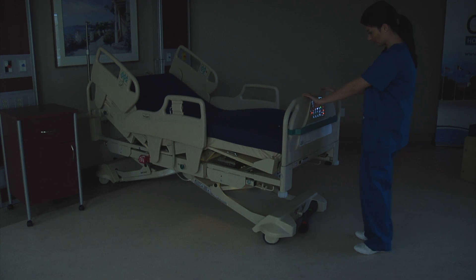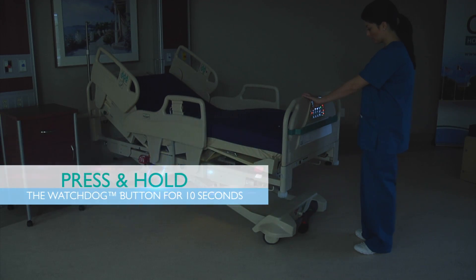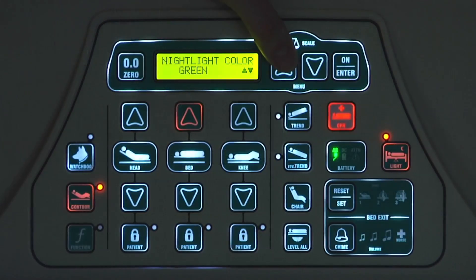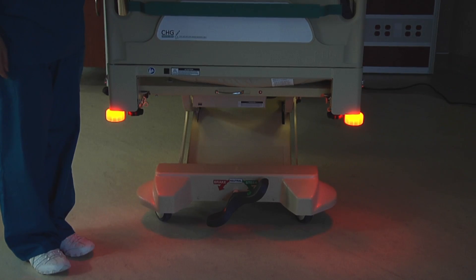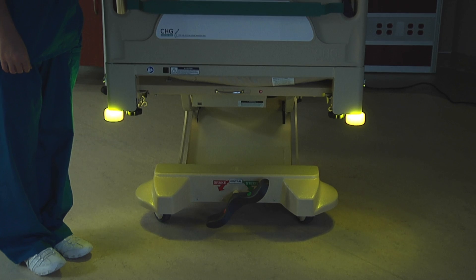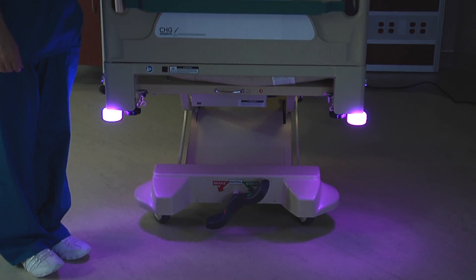Finally, the Watchdog lights can be used to provide ambient room lighting. To use Watchdog for room lighting, press and hold the Watchdog button for 10 seconds. The nightlight color selection screen will appear on the LCD display. Use the up or down arrow buttons to scroll through the color choices, then press the ON or ENTER button to select the desired nightlight color.